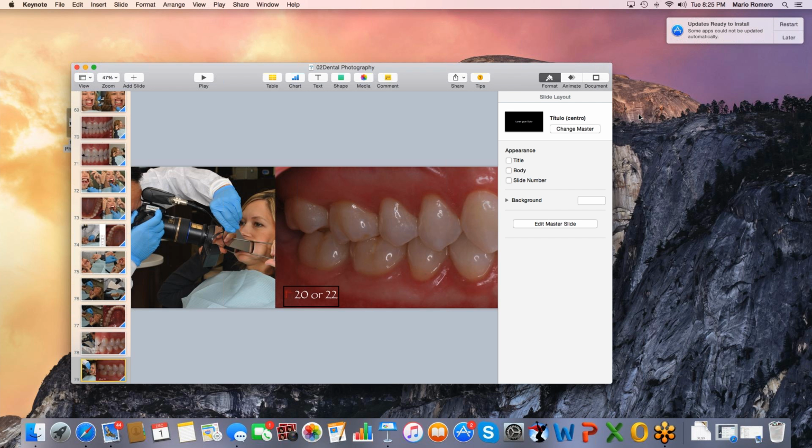We do wrap them very nicely when we send them to be sterilized in gas because we don't want them to get scratched, but they will eventually get some scratches. When they get a lot of scratches, we just throw them away and buy a new pair. Like I said, you're going to spend $100 on mirrors and probably $125 with a black contraster. I don't think that's a bad deal for something that we are charging for, because in my fees I have included everything behind the curtains, my photos, everything I put into my work for the benefit of my patient.